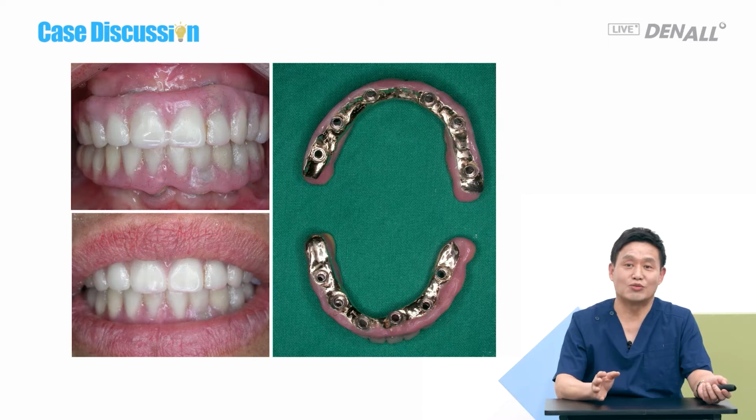But later she said her lips are wrinkled and look older than when she was wearing temporary. Chewing is much more comfortable, but she looks old. It was her choice, so it was not a problem, but the anterior prosthesis was very challenging in this case, even though I didn't do it myself. So just like the case under discussion, when lip support is important, you talked about hybrid type. Even hybrid type is not good enough to give the lip support.